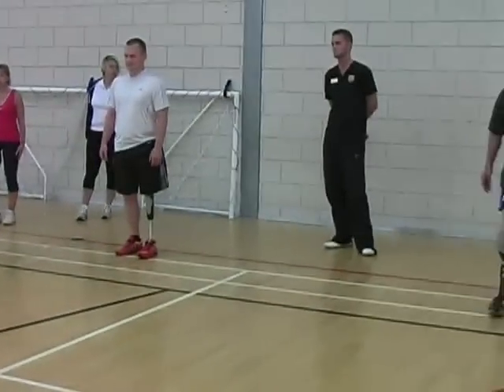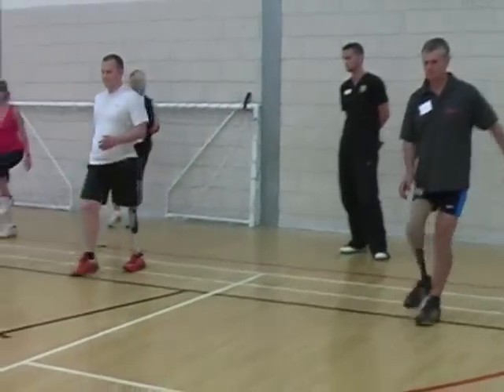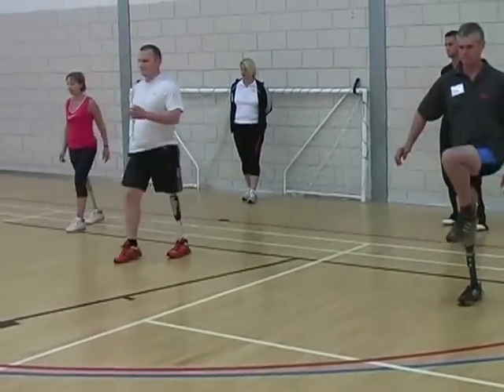We'll do that two or three times through. So just practicing where your awareness is.